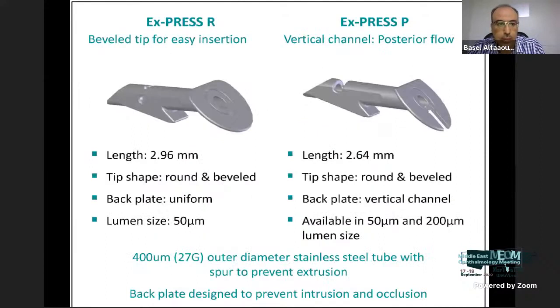Two main types were available, the Express R and the Express P. The Express P is still available now, the Express R is not available anymore.